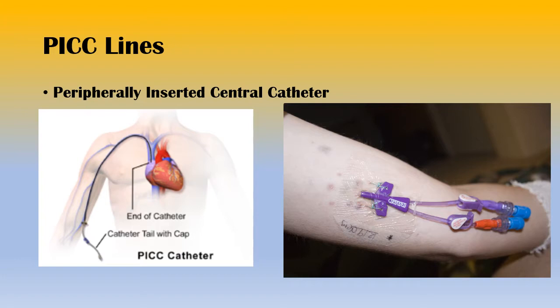Patients can have these in for up to 90 days. So very common with patients that are chronically ill and that have to have medications at home. So PICC lines are fairly easy to deal with. We're going to show you how to do that next.